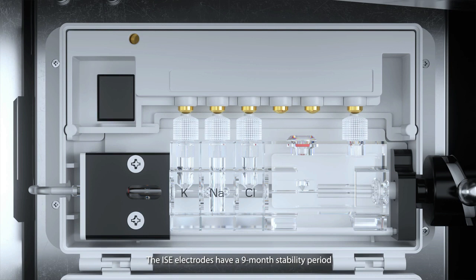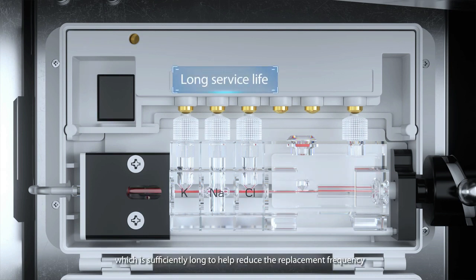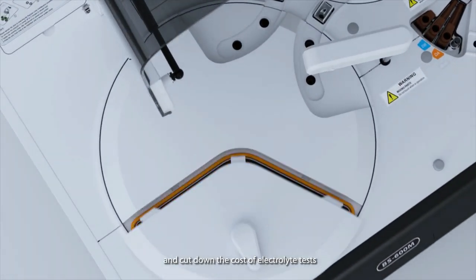The ISE electrodes have a nine-month stability period, which is sufficiently long to help reduce the replacement frequency and cut down the cost of electrolyte tests.